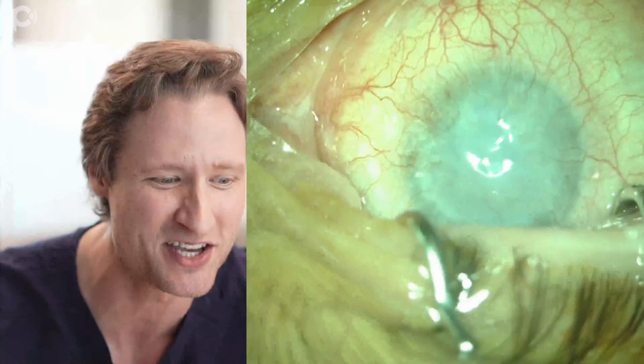I want to show you how to do impossible DMEK. Let me show you an eye that I operated on yesterday, which is one of the most difficult cases that I've done this year.